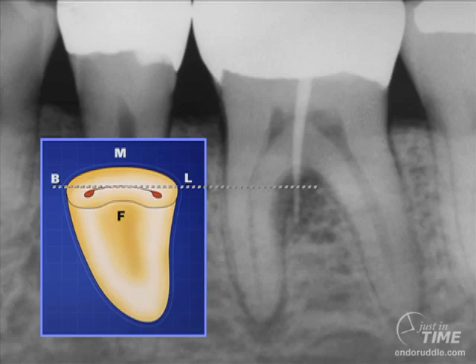Let's come back to the furcal side concavity. You can see in the inset image there is a strong furcation, and again, as we've noticed earlier, the canals are not centered in the mesial distal dimensions of the cross section. If you look at the radiograph, you can see that there's a big furcal lesion. There's a gutta-percha point that's tracing through the sulcus buccal, and it traces to a lesion of endodontic origin. You can notice in this image that there is quite a furcal side concavity, and you can begin to notice the coronal aspect of the canal and how it awkwardly bends into the pulp chamber.